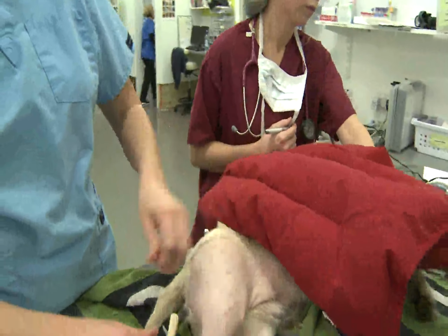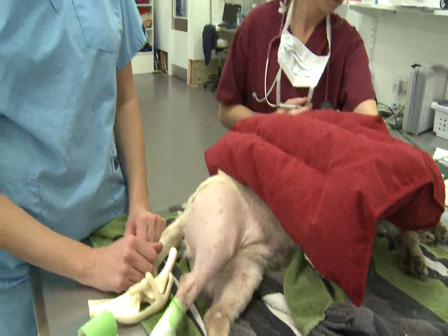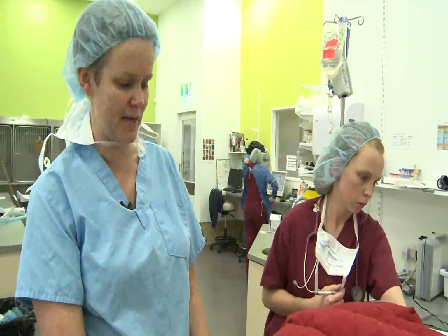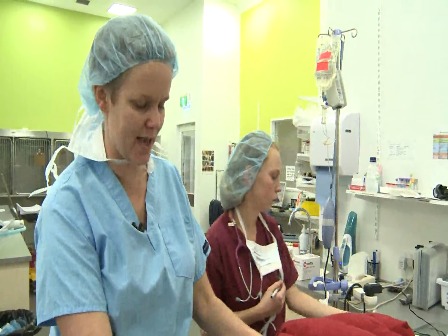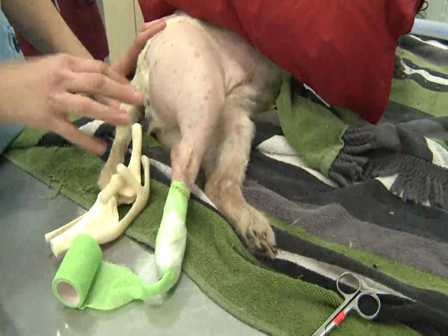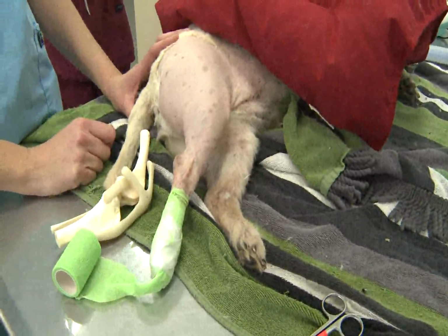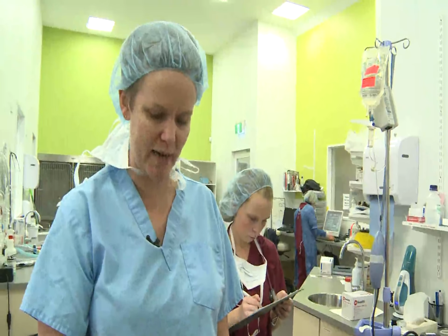And there's several different types of surgery that can be done for this injury, and the one that we're going to do on Clyde today is called a triple tibial osteotomy. It involves redesigning his knee a little bit so he doesn't have any movement between these two bones when he stands on his knee. So we need to do quite a lot of x-rays and measurements and planning to make sure we do this correctly for Clyde. So we can go through and have a look at his x-rays and see the pre-op planning that goes into this surgery.